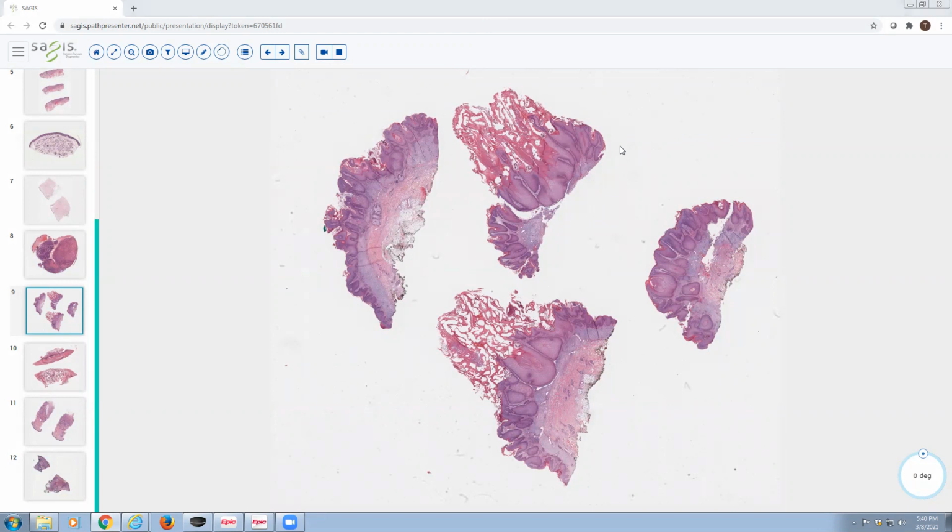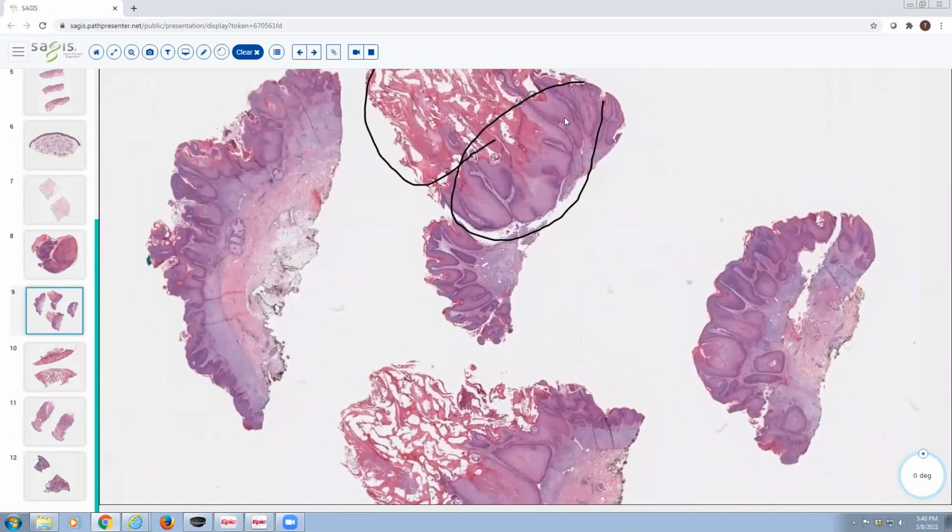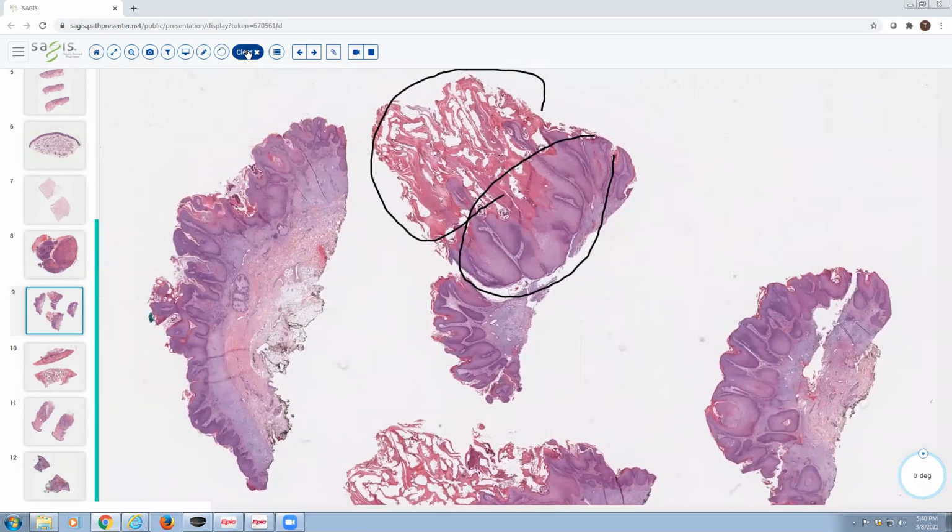Okay, so we've got this proliferation of epithelium here, which makes the epithelium look acanthotic. So you've got this acanthotic epidermis, and also notice how hyperkeratotic it is. You've got this really crazy hyperkeratotic cornified layer. And on scanning magnification, it looks almost like a neoplasm. You're concerned at least about that on scanning.